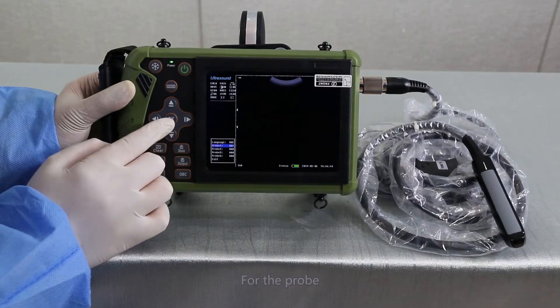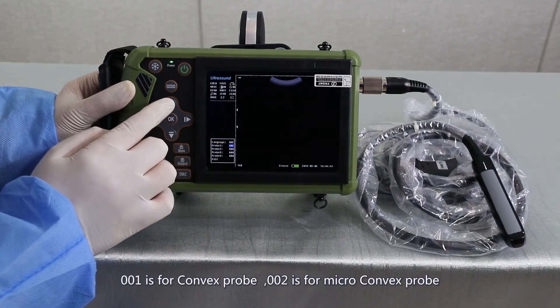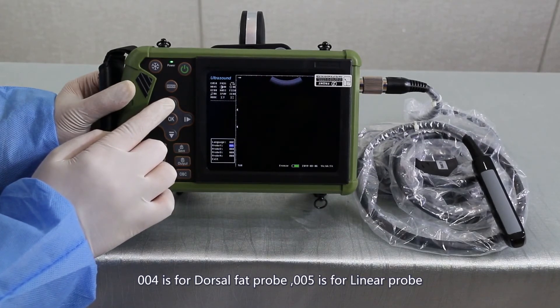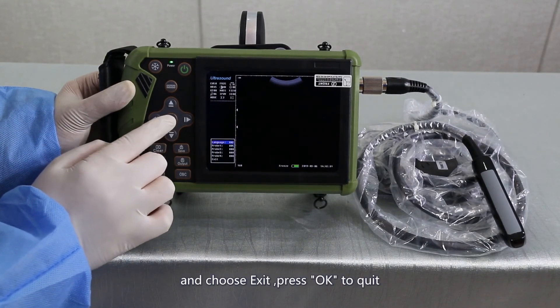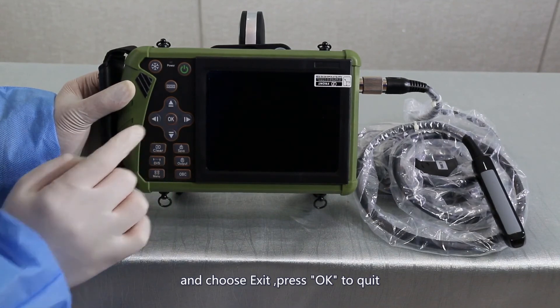For the probe type, 001 is for the convex probe, 002 is for micro-convex probe, 003 is for rectal probe, 004 is for dorsal fat probe, and 005 is for linear probe. After setting, choose Exit and press OK to quit.